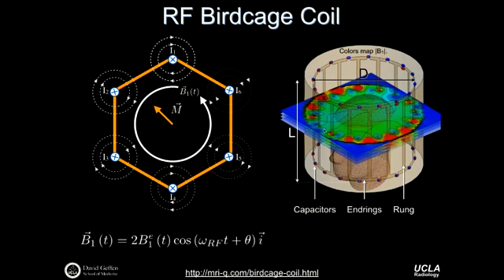So if the color is very flat, it's basically green, that means we're getting effectively the same flip angle everywhere as well. Now there's a relationship that's not easily known because it depends on the specifics of the design of the head coil itself, but those currents effectively generate B fields. It's the B fields that we care about. The B fields are what rotate the transverse magnetization.